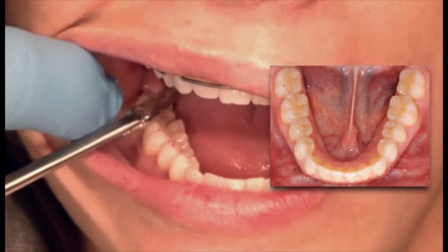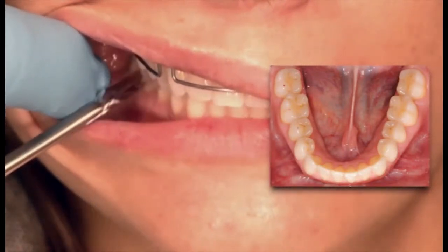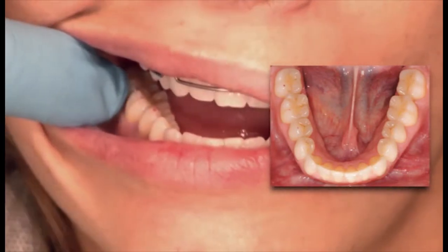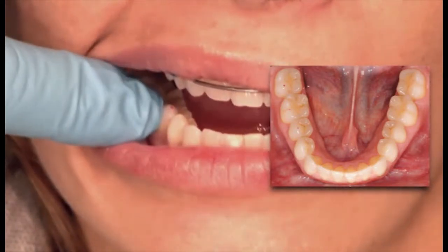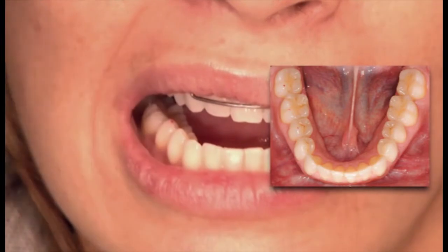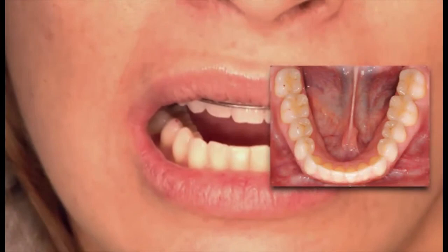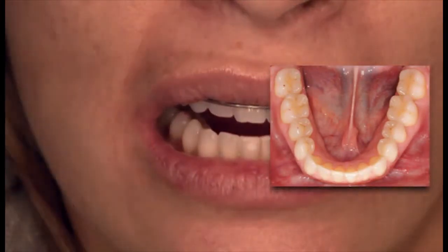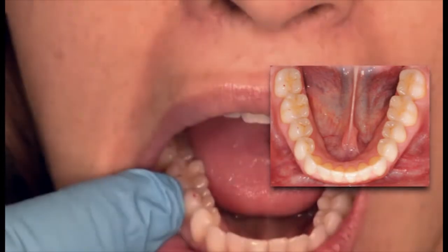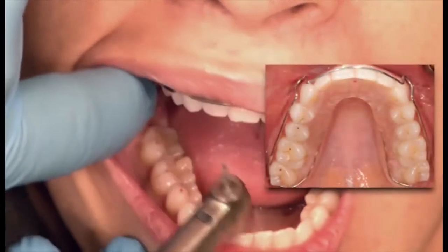Open, close. See, in the back, it doesn't really hold. Close. You see, so we have actually false positives on those posterior teeth. This is the only one that actually touches. And what I'm trying to do is create a mind-body connection for the patient, so the patient can actually feel which tooth it is. So in effect, it is only this bicuspid. Now again, it's on the cusp tip. I'm going to come back and deepen the fossa.